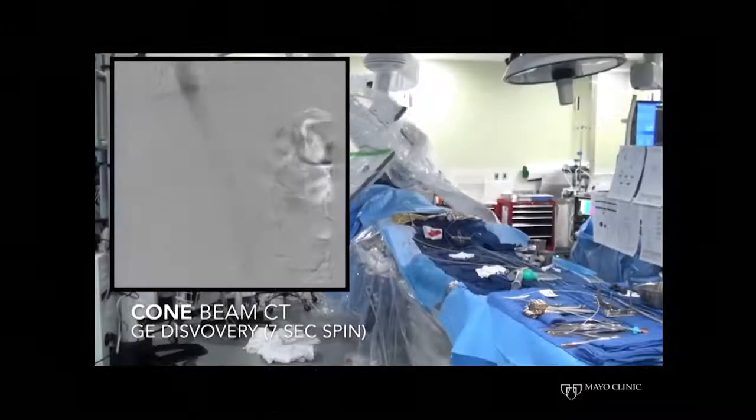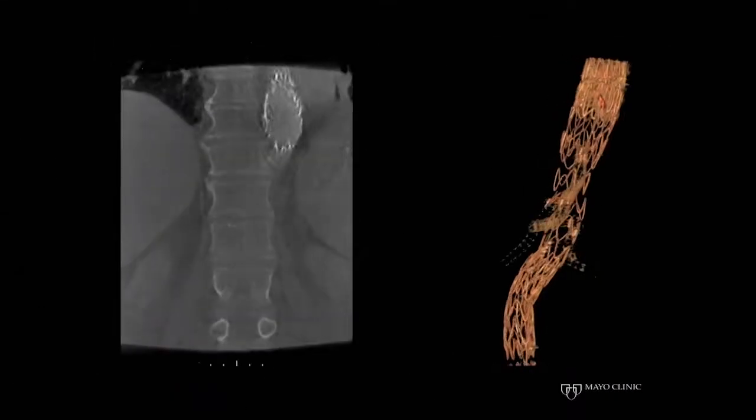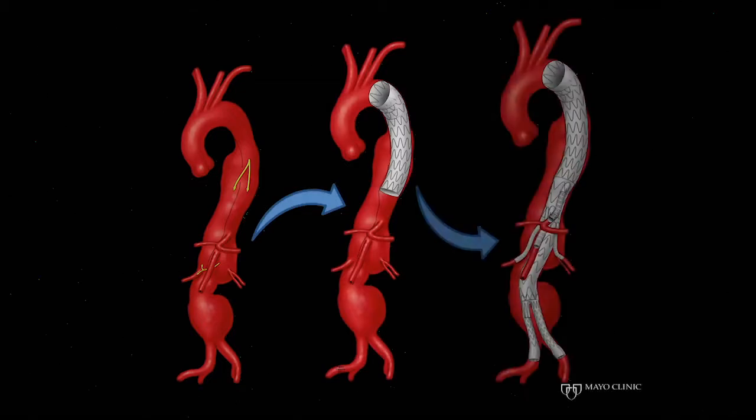standard technique, and also a cone beam CT with and without contrast using high resolution imaging as depicted here, with demonstration of the coronal view and also the sagittal view, revealing no evidence of technical defects, compressions, or endoleaks within the stent. This patient progressed well without complications and was dismissed on day 5. This case also illustrates the extensive repair of a thoracoabdominal aneurysm in multiple stages, first with thoracic endovascular repair, and then with a completion branch endograft to connect to the distal landing zones.